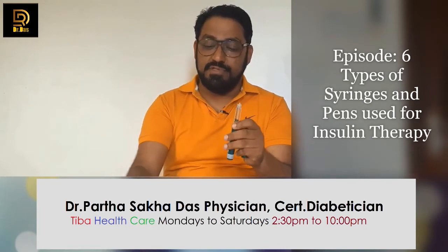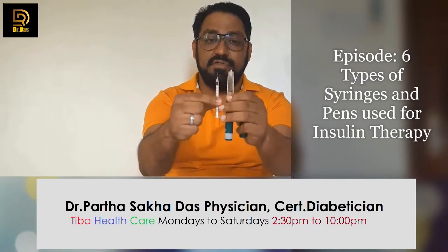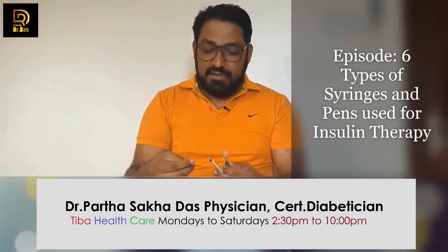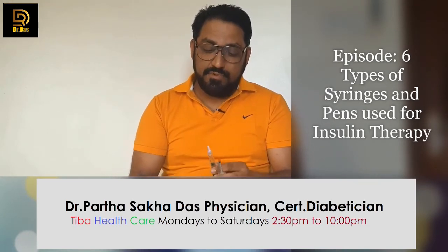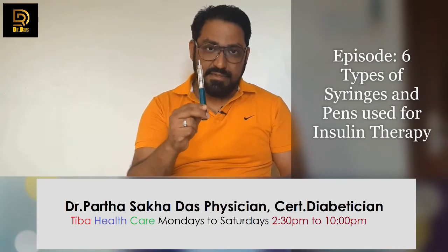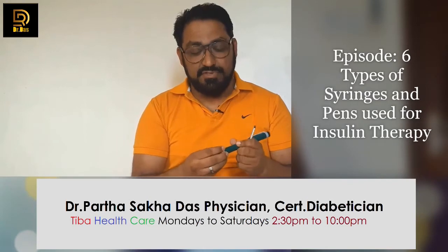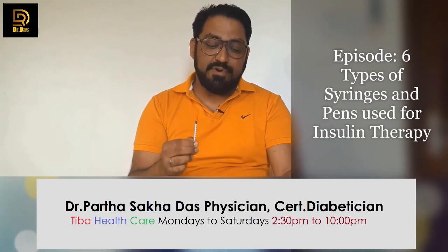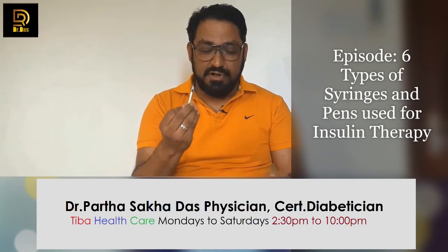Now if you compare it to this insulin syringe, you can understand this is much thinner. So this is like this much and this is like this much. But many people ask us in the clinic, shall I use this one or is this better? Well, if you talk about compatibility, this is very easy to use because you just have to measure how much you have to take and push. But with the syringe, many people don't feel comfortable because it's longer than this.